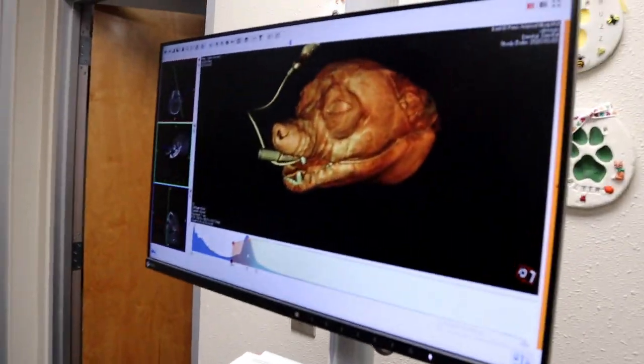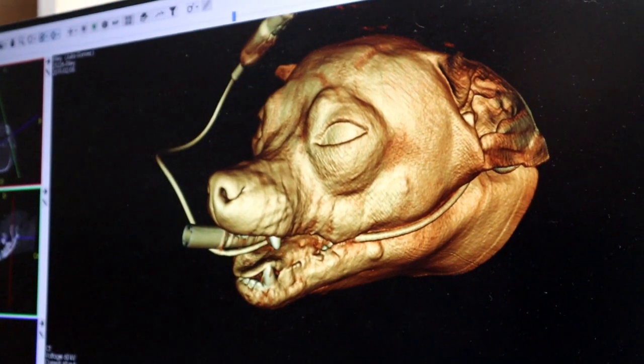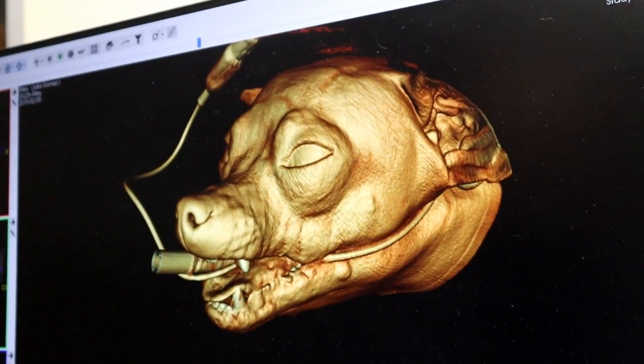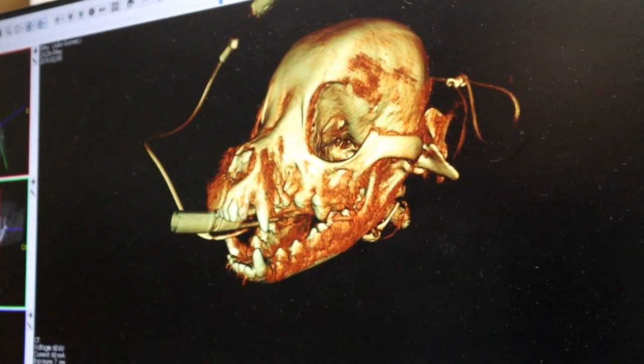You can add tissue effects — it's a bit scary looking. You can add more of the colors to get more of a reconstruction of the face. As you take layers away, you start to get underneath the tissue and see more of the skull.